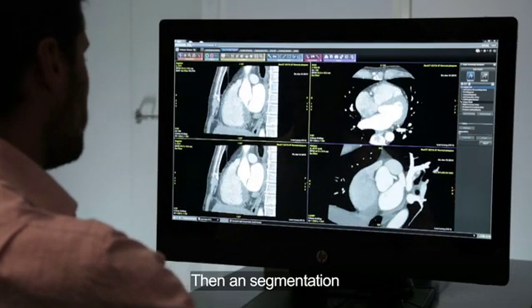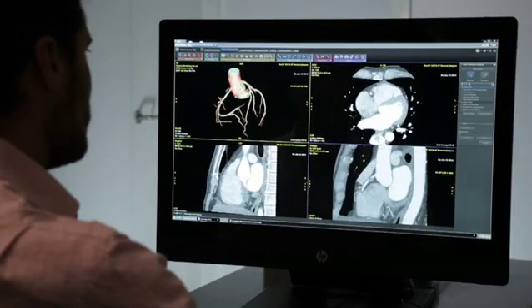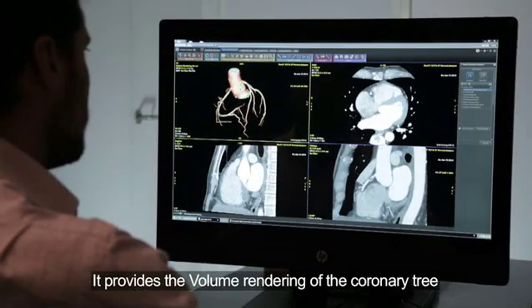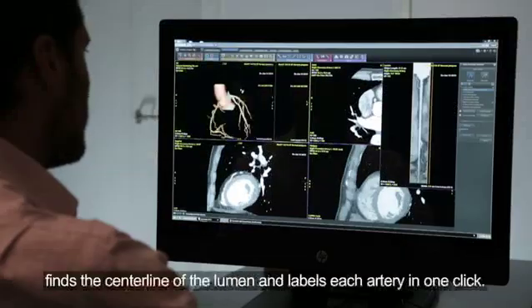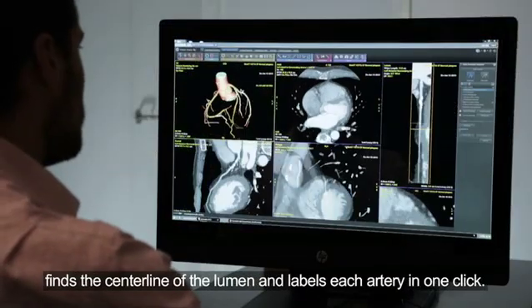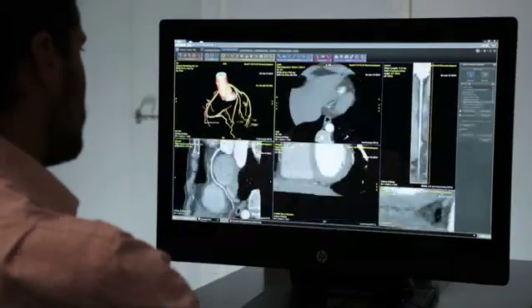Segmentation of coronary arteries is performed, providing volume rendering of the coronary tree. It then finds the center line of the lumen and labels each artery in one click.